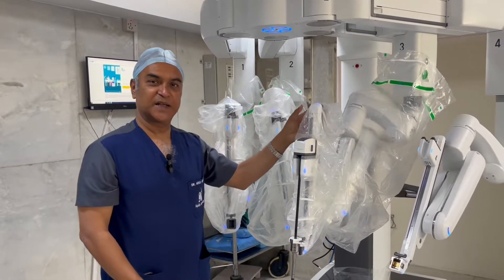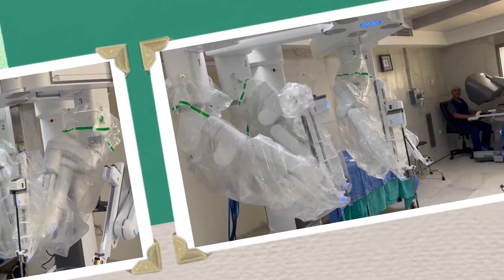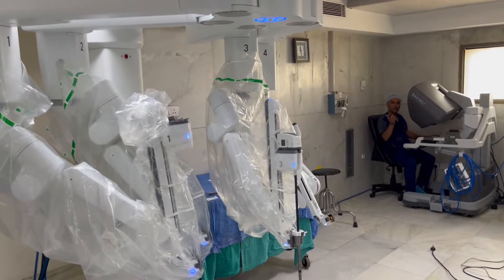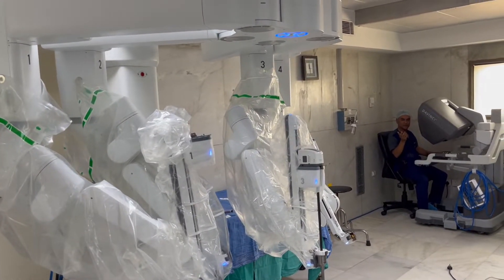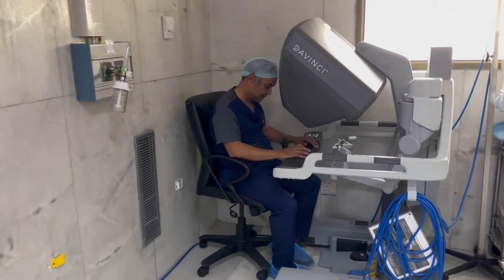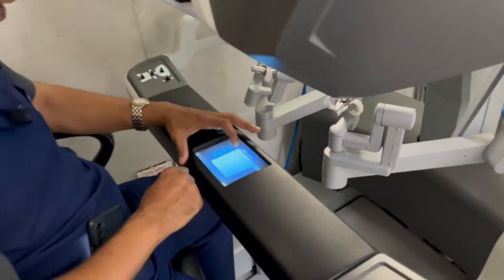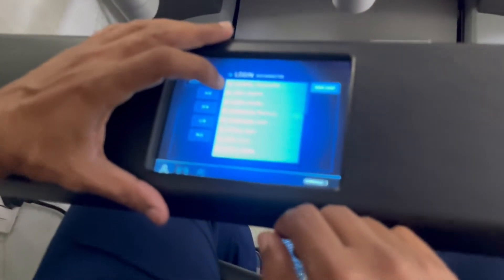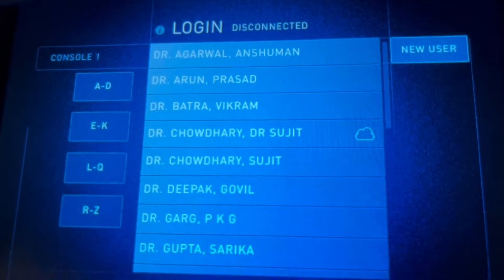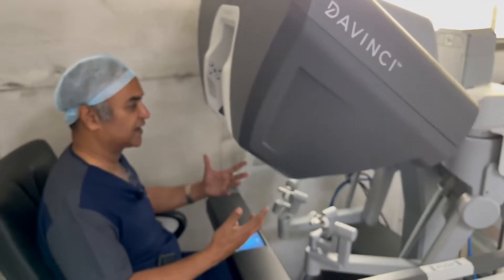So these are some of the benefits of the robot which we have just seen. Next, I will take you to the console. Now that we have seen the parts of the robot, I will show you how the console works. This is the robotic console where the surgeon sits. There is a screen here which tells me how to log in. I look for my name, touch my name, and this takes it back to the position where I had set it — like a Mercedes where you set your own position.